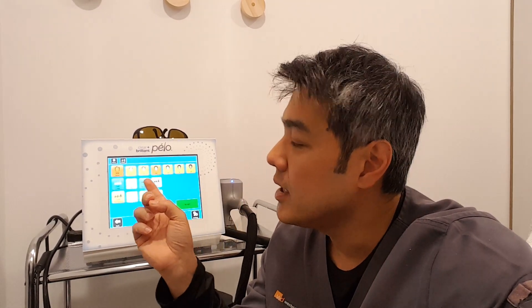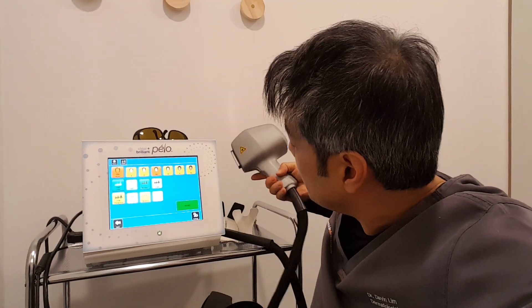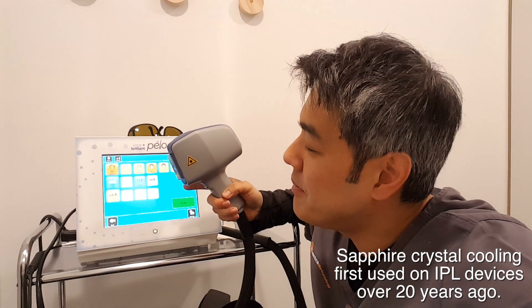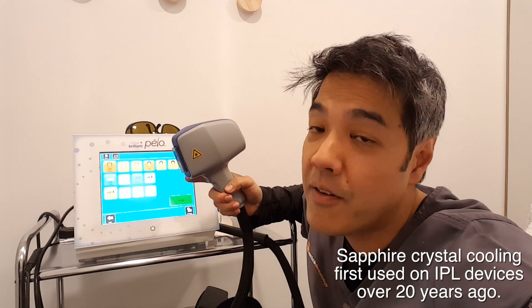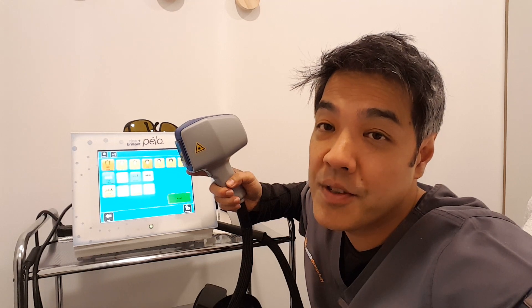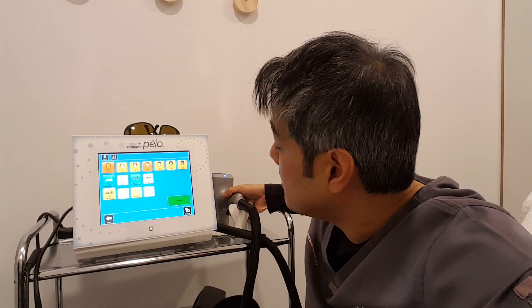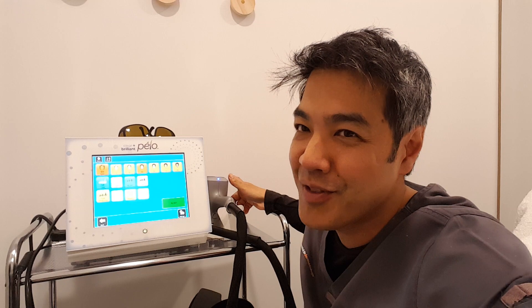So really quickly: it's an 810 diode, it uses sapphire crystal cooling — an old-fashioned cooling system we've been using with IPL machines for about 20 years. But it works with a scanner mechanism, which means it should be less painful. I've had the Lightsheer Duet done by Luminous, so I know what pain feels like with that. I've also had 755 lasers, so we'll see what this one does very shortly.